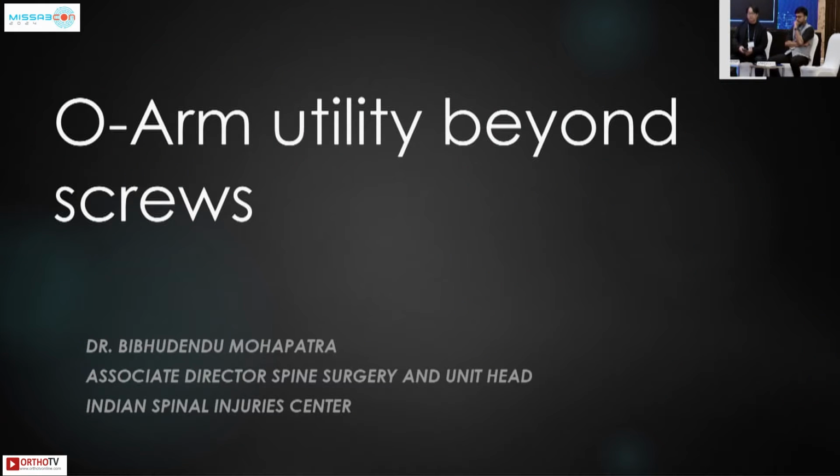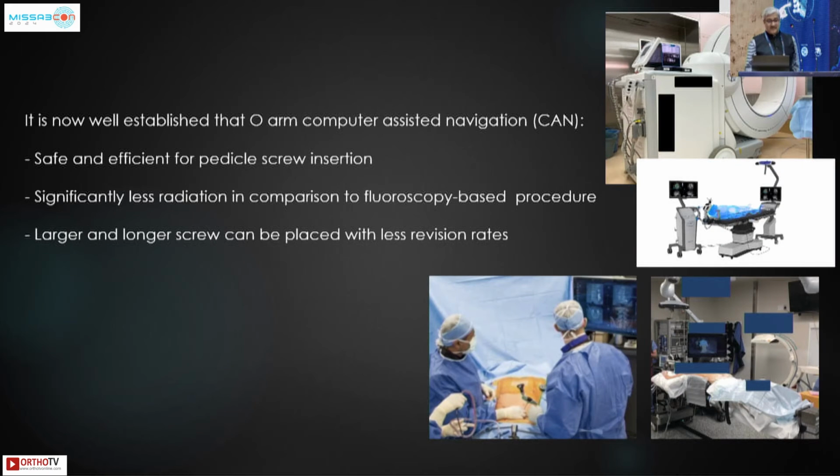From the screws, we are going beyond where we can use the O-arm. It's well established that the O-arm and navigation help us put in screws safely and with less radiation, and larger and longer screws can be placed with lower revision rates.